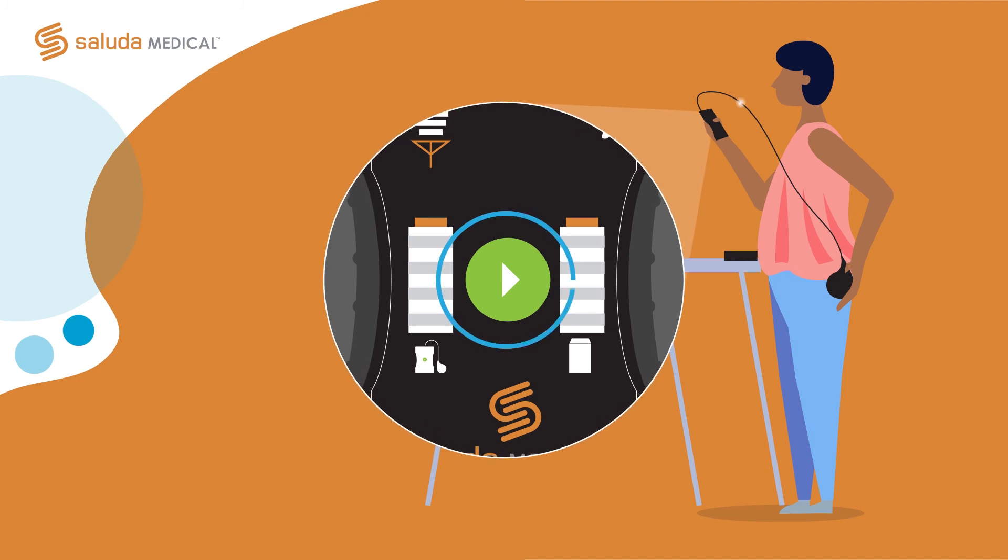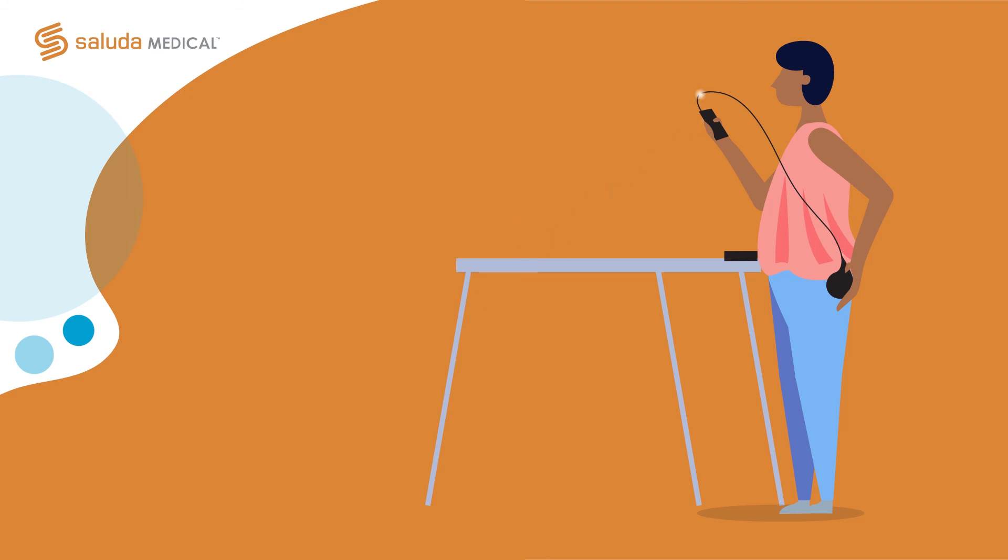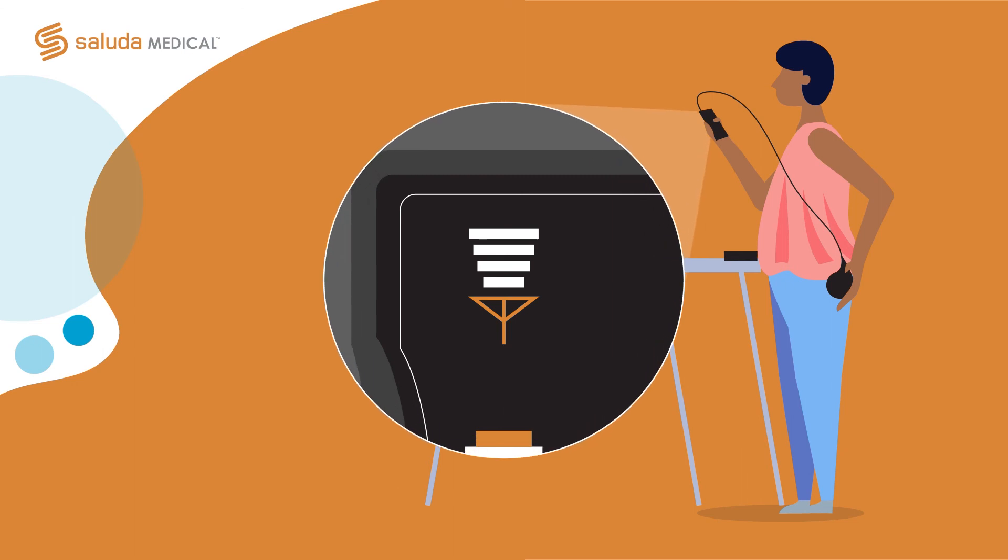Press and hold the green button for more than one second. The charger will beep every second until the coil is aligned with the stimulator. The charging link indicator will then show at least two bars. Move the charger coil until the link is strongest. The charging link indicator should then show three or four bars.